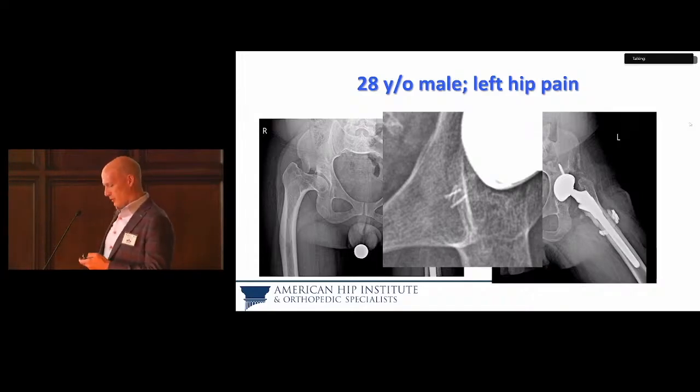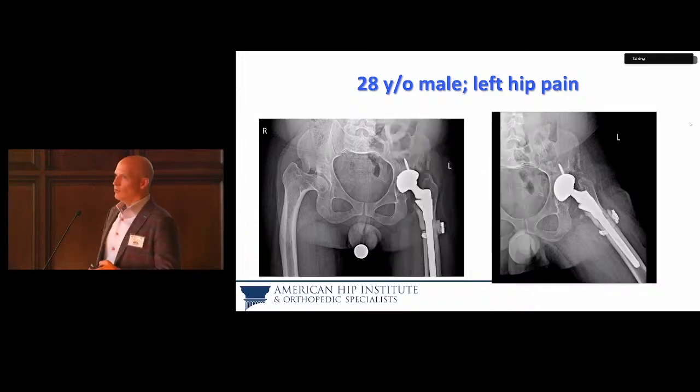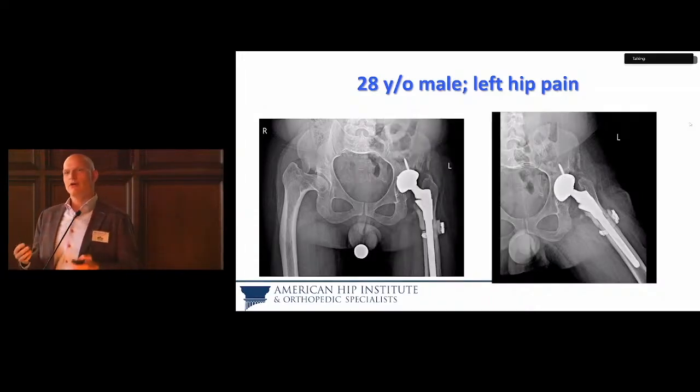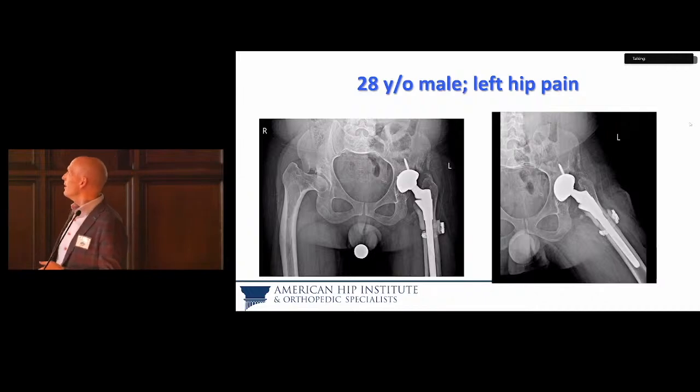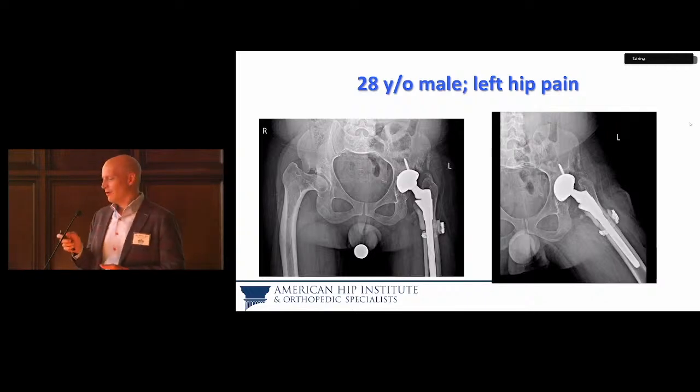He still looks pretty good in my opinion. He's pretty stable. He was pretty happy with his result. But again, you have to be ready for dealing with all these things during surgery, which again, given some of the complex PAOs you guys do, that should be nothing for you. But as an arthroplasty surgeon, hitting a big vessel where you normally don't expect a vessel can be challenging.